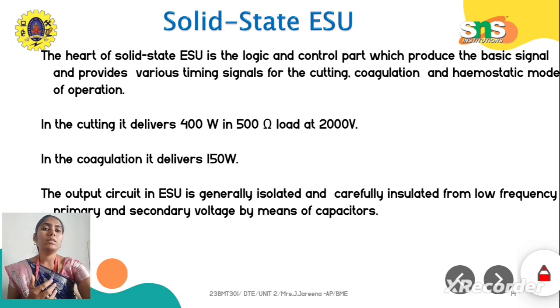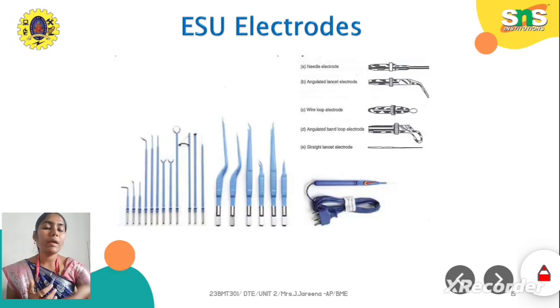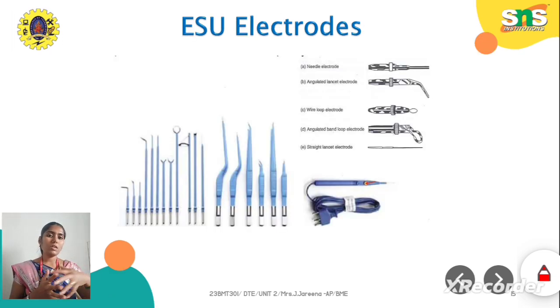Next we will be discussing the different electrodes we can see in the ESU unit. There are plenty of electrodes. Based on the application, we can use different sorts of electrodes. The different types are based on their tip, how it has been designed.